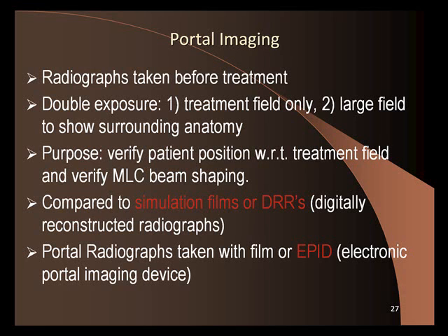And again, what's portal radiography for? What's the purpose of portal images? To make sure what? What are we looking at?